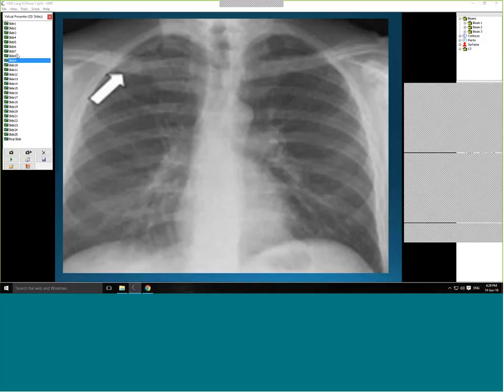in our simulator lab so the students are well trained on reading films, setting the magnification factors, using bony anatomy to set clinical fields for emergency patients, as well as for CT sim purposes. Students will isolate the tumor, draw the treatment fields using this GTV, the CTV, irradiated volumes, as well as determining treatment field sizes to set on the machine. We will then verify that with the 3D imaging.